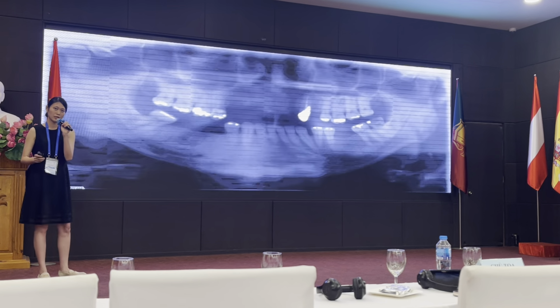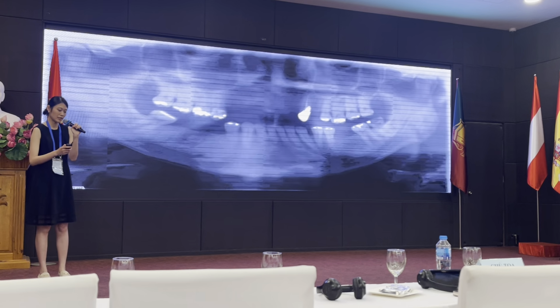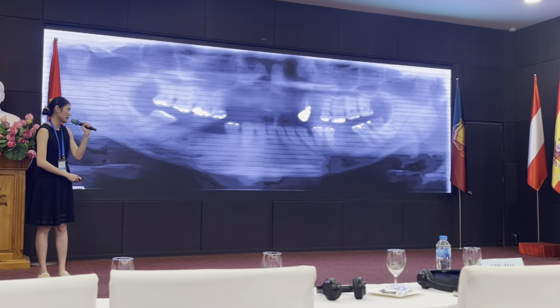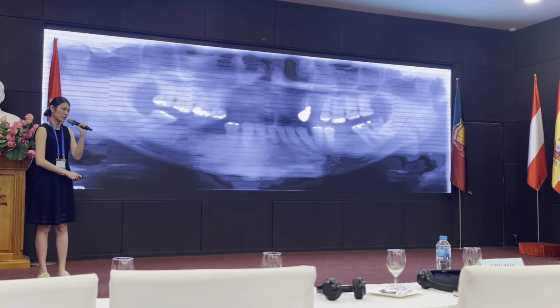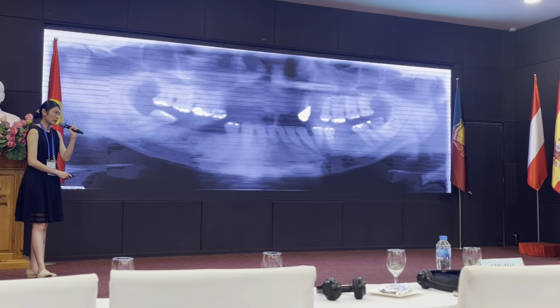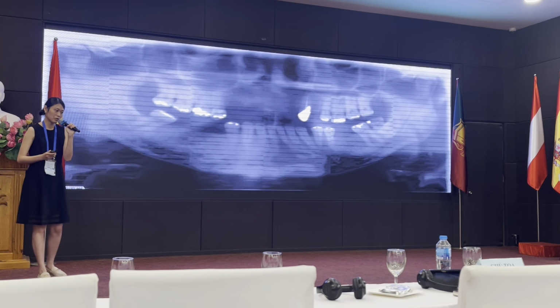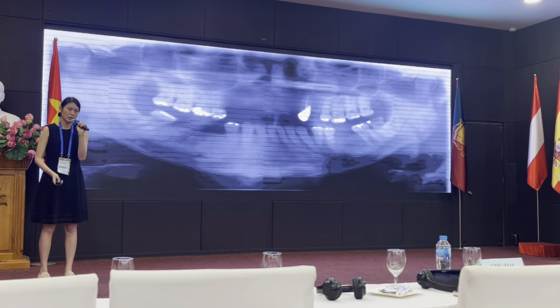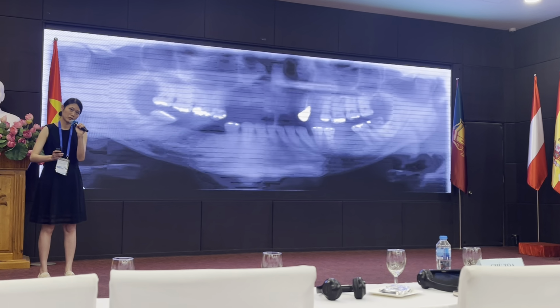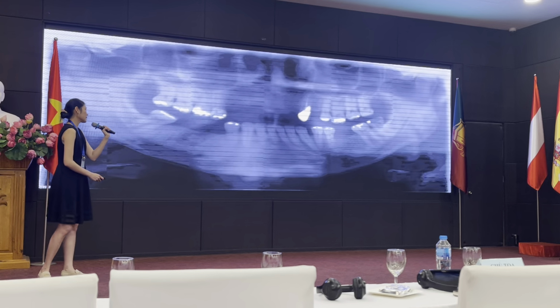And the second thing, in addition to CBCT, you want to take the panoramic film and periapical film, because that will give you the general idea about where your bone level is. And before we place any dental implants, we have to build a foundation well. That means ideally we should treat the periodontal disease properly before we do any prosthetic work.